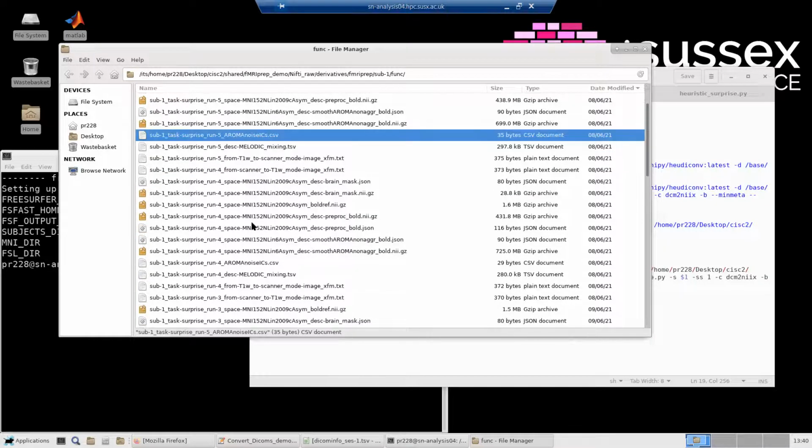I have a question about that. In other ICA denoising steps, there's often a manual intervention process where you have to assess whether each of the components is signal or not. Has that been standardized for this, where you don't have to do that, it just does it all automatically? And then before you answer, did the people at home hear that question? Yes, they did.